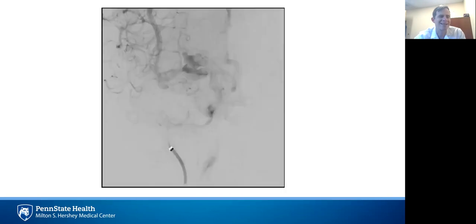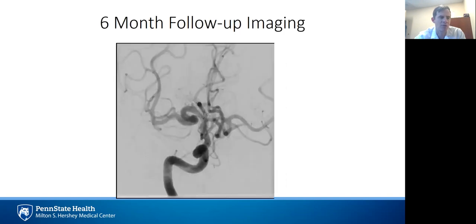As is expected for flow diverters, aneurysm obliteration is not immediate, though some stasis can be seen here immediately post-deployment, which in general is a good prognostic sign for eventual aneurysm thrombosis. The patient was continued on dual antiplatelet therapy, as he was a verified Plavix responder with assays, until follow-up at six months, showing remodeling of the fusiform portion of the vessel with complete exclusion of the excrescences.